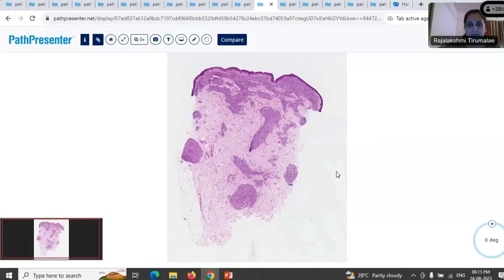Yeah, go ahead. Okay. H&E stained sections are showing normal looking epidermis, but we can see that there is a hypocellular zone separating the epidermis from the papillary dermis, which is called the Grenz zone, and we can see dense inflammatory infiltrate. I'm deliberately not going to the higher magnification because there is something I want you to pick up on scanner view.